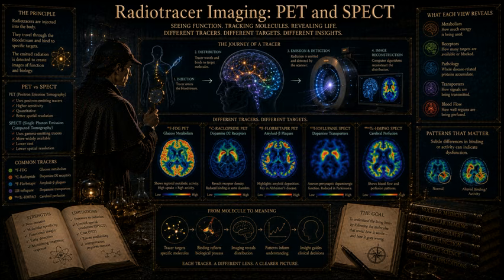Yes, this tidal wave of endogenous dopamine violently binds to the D2 receptors. We then scan the patient a second time with the radiotracer. This time, our raclopride tracer has to compete for parking spots against that massive flood of endogenous dopamine. Let's say in this post-amphetamine scan, we only find 85 available VIP spots for our tracer. We calculate the change in binding potential, the delta BPND. In this case, a 15% drop. That drop is our proxy measurement for how much dopamine was released.